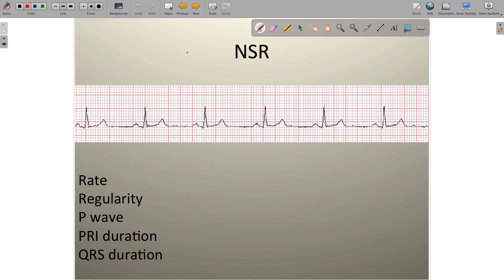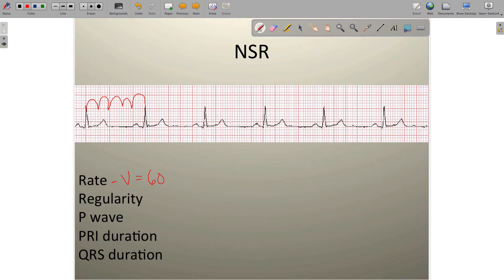You'll have these to serve as a reference for the future in addition to your book. Let's pick out the rate first — we'll do the ventricular rate by finding our QRS complexes. Using the sequence method: 300, 150, 100, 75, 60. It's right around 60, so let's call it 60 beats per minute. Now let's look at the regularity of the rhythm — is the distance between these QRS complexes the same? Hold up a little piece of paper to your screen to check.